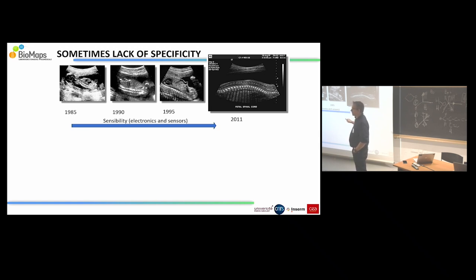I just showed you the classical Doppler. But with what we call ultra-sensitive Doppler or ultra-fast Doppler, that I will show you later, I think it will be possible to look at coronaries. I will not speak about coronaries today, but I can show you on my computer later if you want.